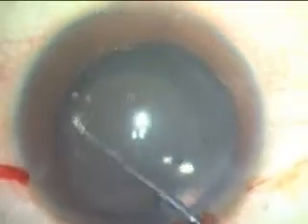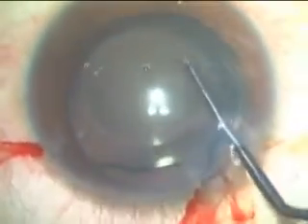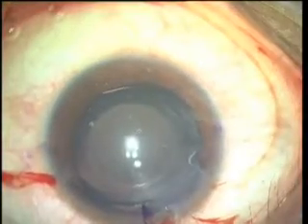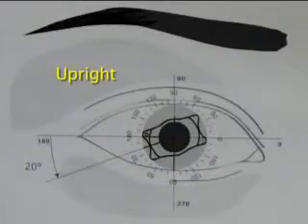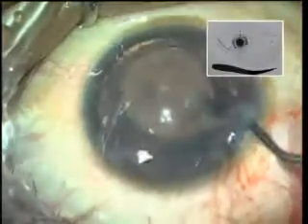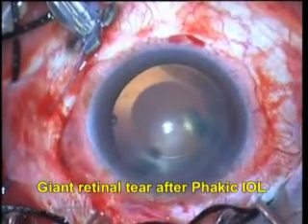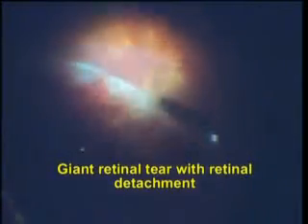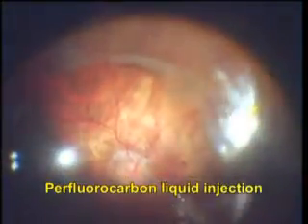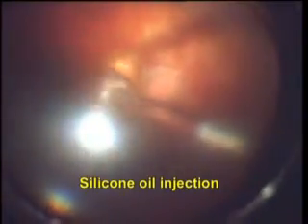Once the toric ICL is injected, it is rotated to have the axis etchings aligned with the axis marked on the cornea. It is helpful to have the ICL placement sheet held upside down to align it correctly to the surgeon's perspective of the eye being operated on. Postoperative posterior segment complications can be avoided by careful patient selection. A rotated ICL, if significant enough postoperatively to affect vision, needs to be rotated again into the correct axis.